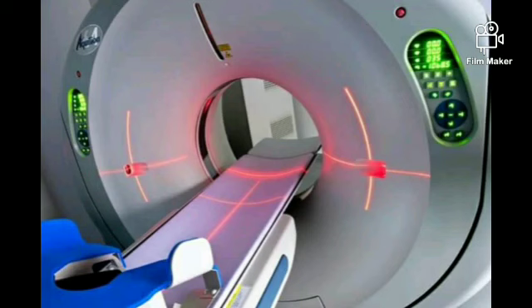And finally you can see the table blink, and the screen displays the table movement and the ISO center. This is very helpful, all these plus and minus degrees, for biopsy purposes, so that you can have an exact location. You can see here at the top this is a scanner line. This is the y and x direction and shows you the isocenter.